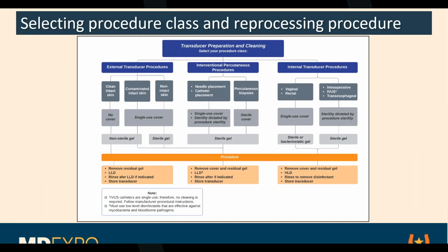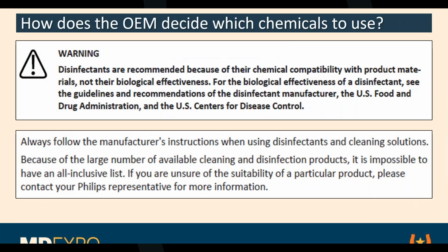Is there a process and procedure in the clinical lab for following? Okay, have they at least seen it? Is there a chart on the wall like this one? That's a chart, just as a reminder, that you need to think through these things, and then that'll determine how to clean it.